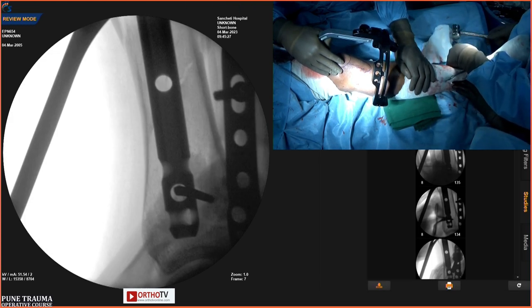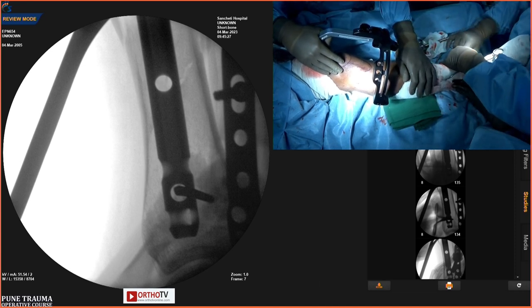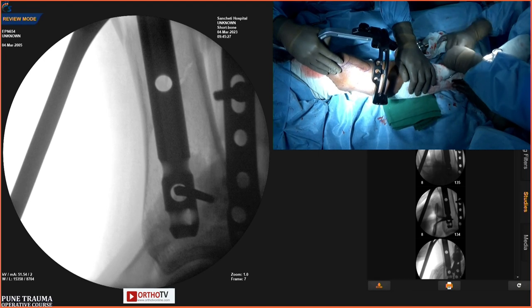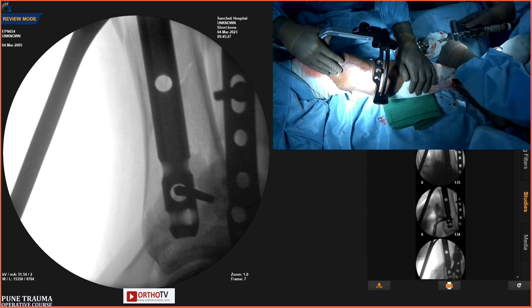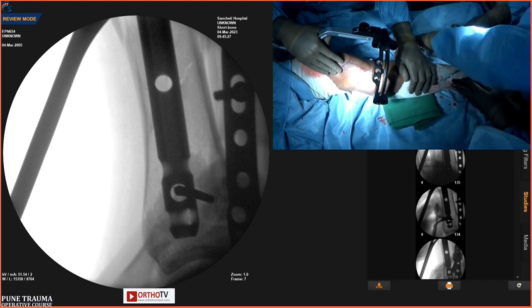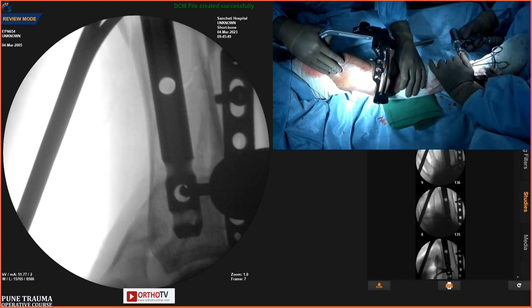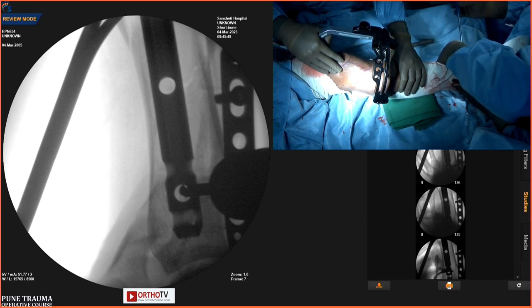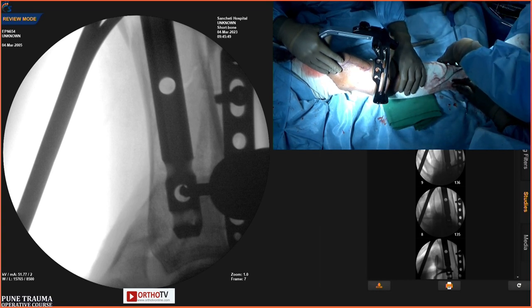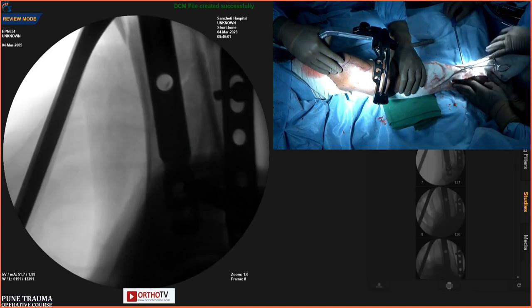Chetan had an extremely good assistant. All should appreciate that with the suprapatellar approach he has used, he has not changed the position of the leg, and the C-arm is going AP and lateral around this patient. This is the advantage. Once you hold the reduction, you can pass the nail from above the knee very easily without changing the position of the leg. That's the most important ease with this procedure. So I have started using this technique even for all the fractures of the tibia.